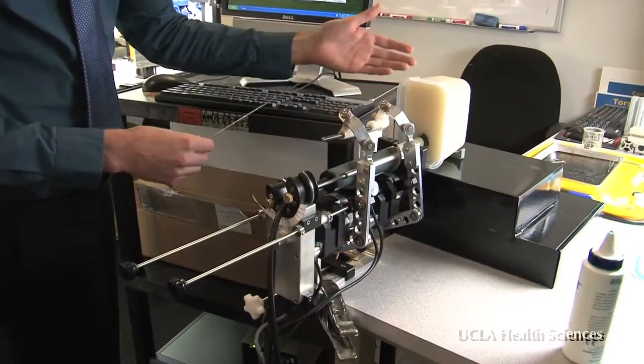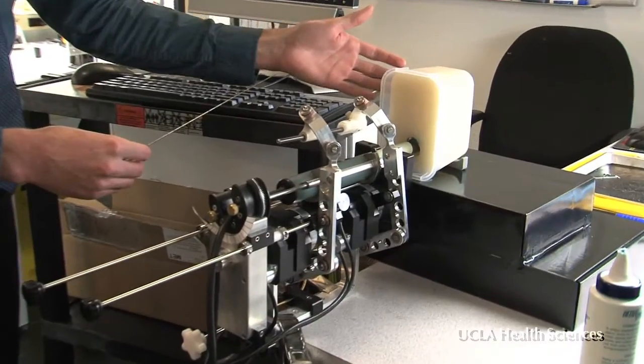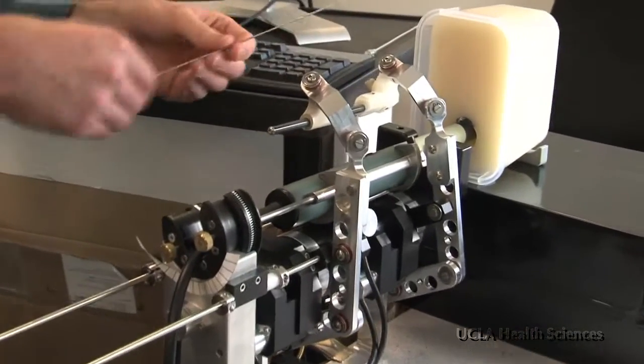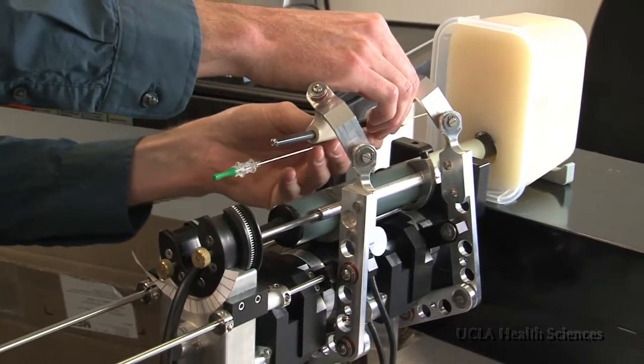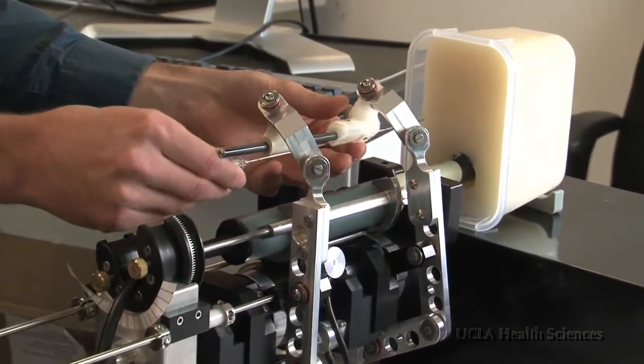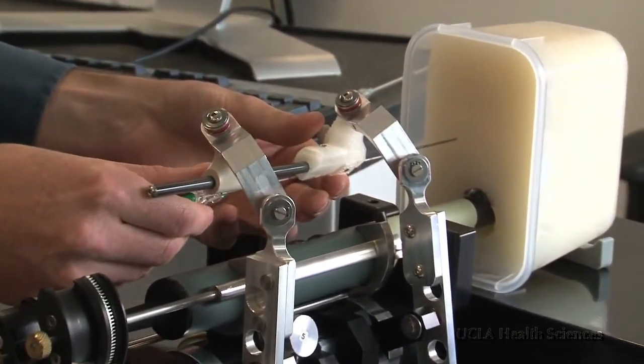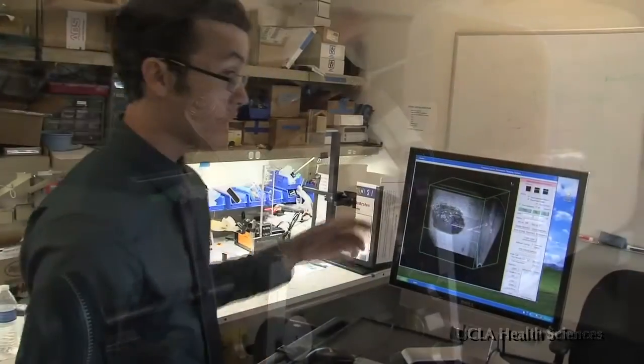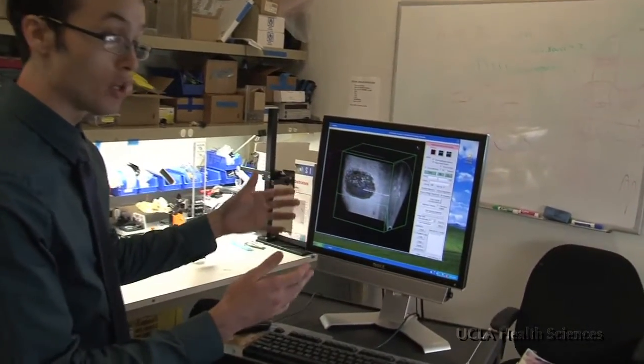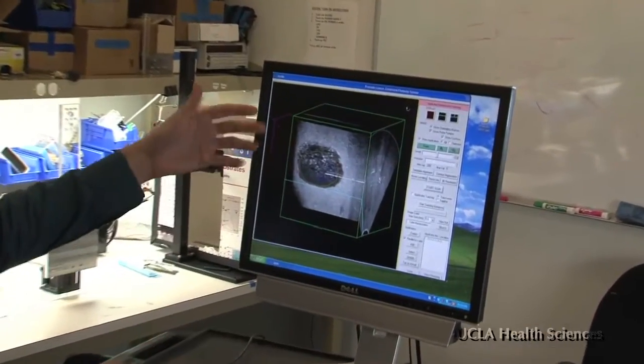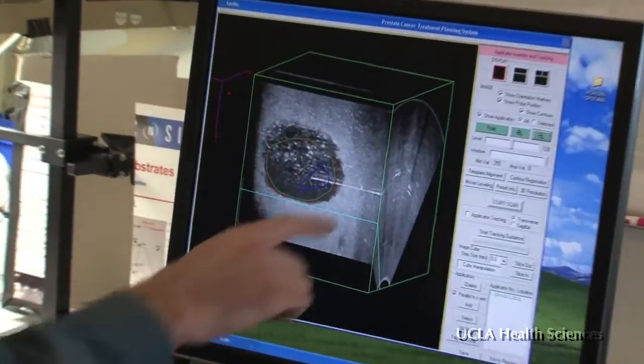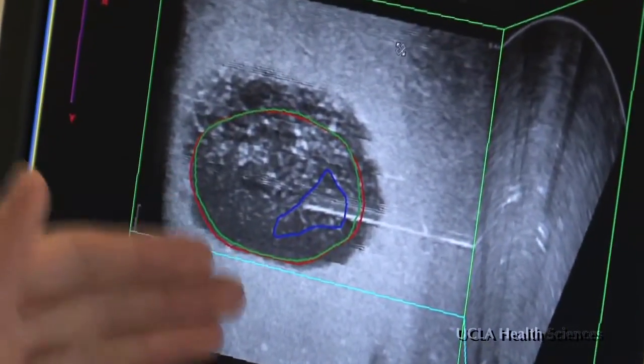This is what we call a prostate phantom. It's a simulated prostate made of agar, a kind of gel. This is a needle going into the prostate that we can then insert into the target. In this blue outline here, that's the actual tumor that's been fused onto the ultrasound scan. This white streak here is a needle that's going directly into the target.